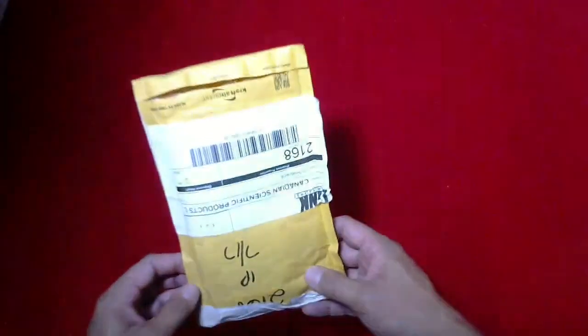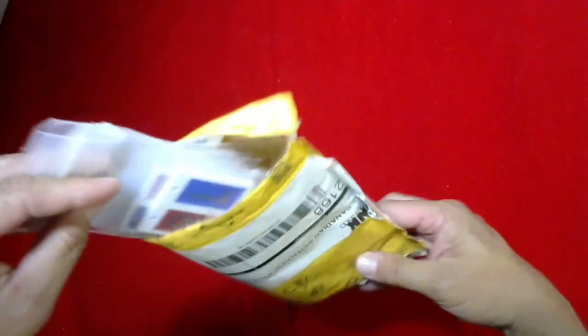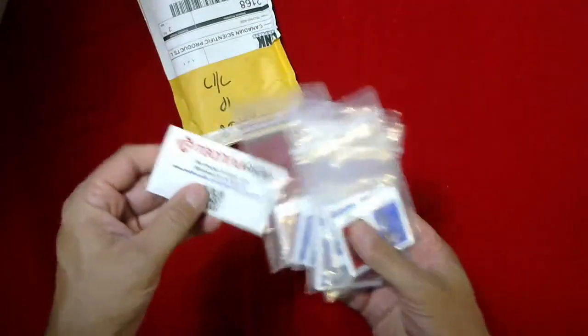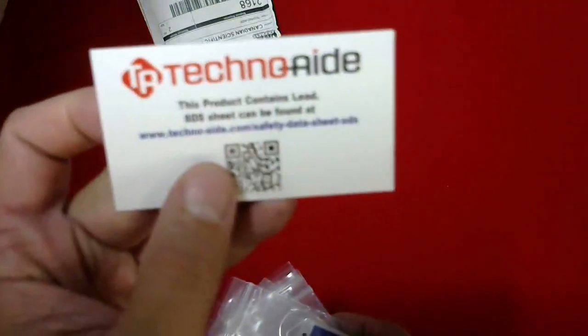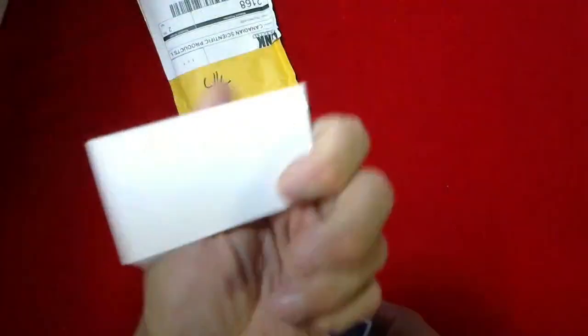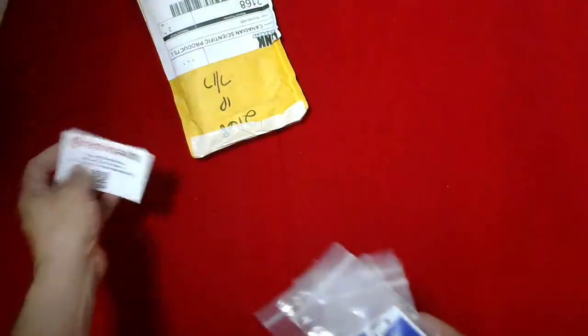Hi, Steve here from CSP Medical. Another quick unboxing, or unbagging. This particular product is from a company by the name of TechnoAid, based in the US. We get quite a few accessories from them.